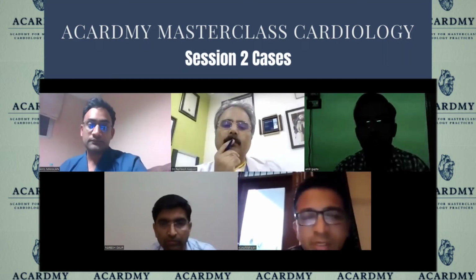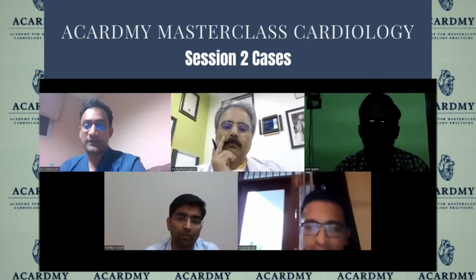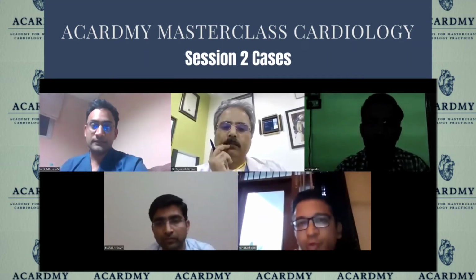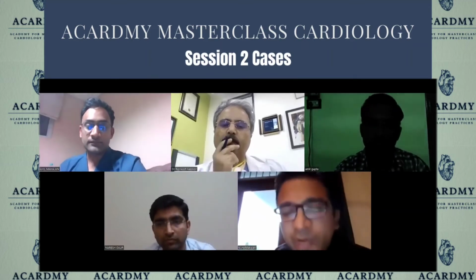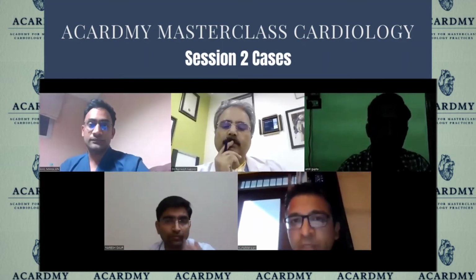That was a wonderful case done by Dr. Sahil. I must congratulate him first of all. In fact, he really showed us how to use plaque modification imaging in a case with a balloon uncrossable lesion.